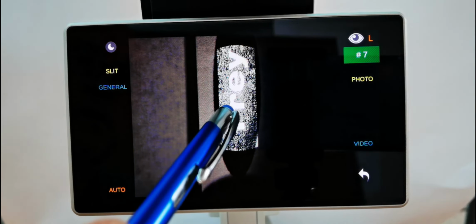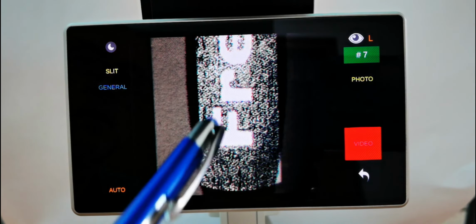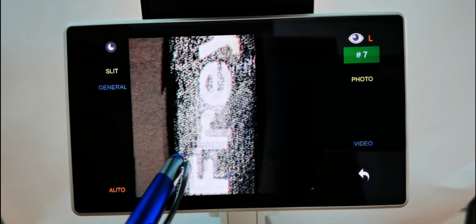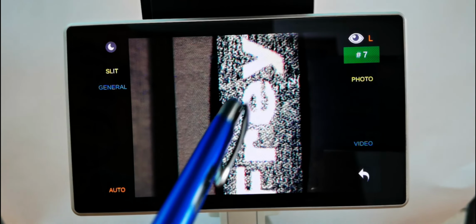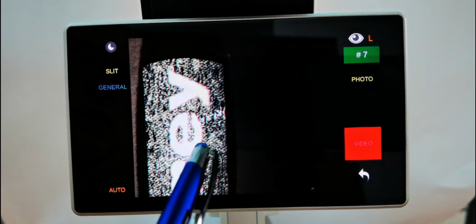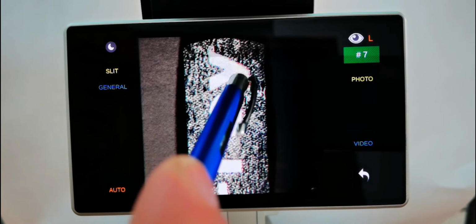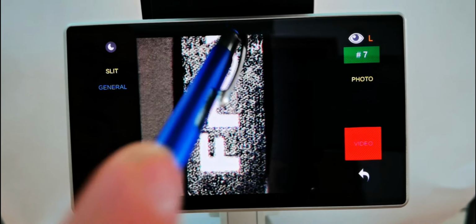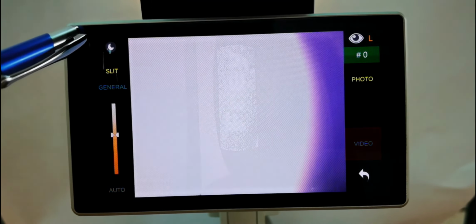During the examination, tap on the camera image to switch between full-frame view and zoomed view. Live Preview shows the entire camera view window in the lower video resolution. Zoom a live image switches to full camera resolution view, cropped to fit the screen resolution. You can drag and center the image to point out the area of interest.